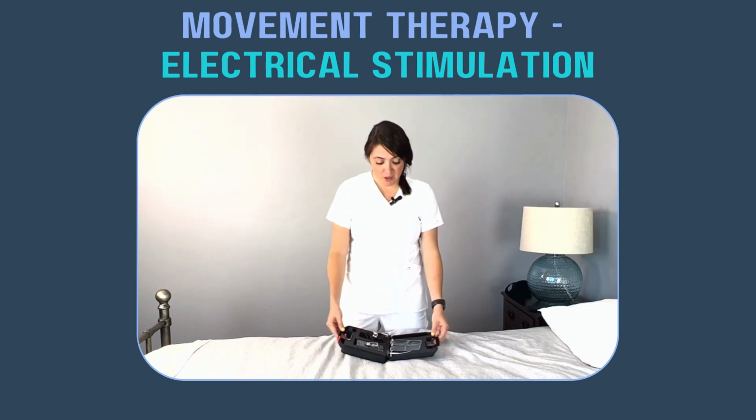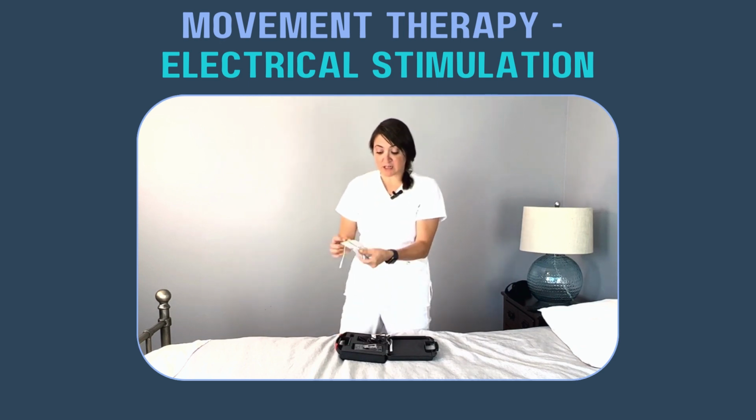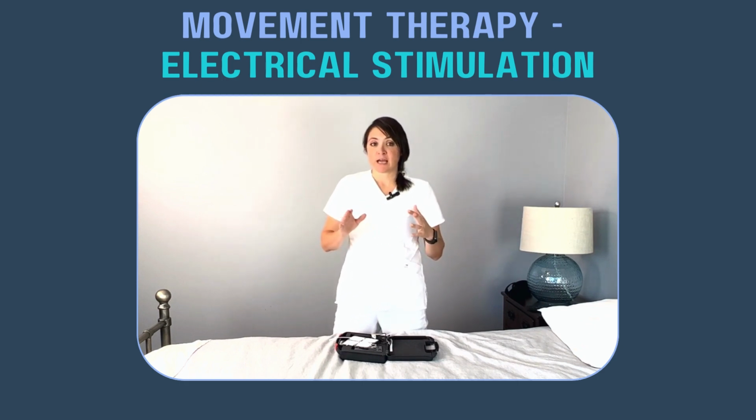So essentially, all electrical stimulation does is it moves a muscle. So let's say I had a normal movement in my arm. If I wanted to move my arm up, my bicep has to tighten or contract for that to happen. So if I get electrical stimulation pads and put them on my bicep, the impulse is just going to help that bicep move or contract. It should not hurt, and we are going to take you through the different areas of the body that you can safely put this on.